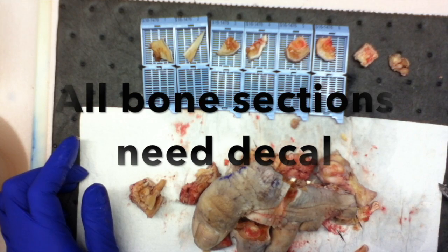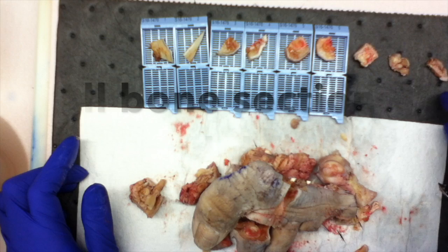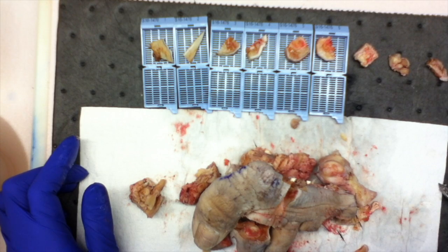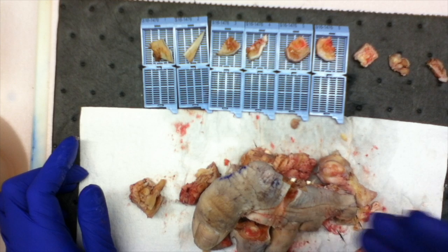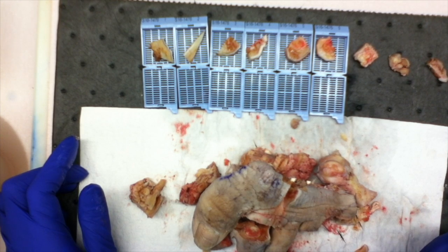And then of course I've got my second metatarsal bone resection margin, third metatarsal bone resection margin, and fourth metatarsal bone margin. And that is how I'm going to do this transmetatarsal amputation.